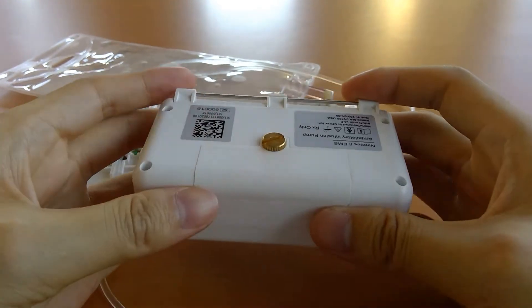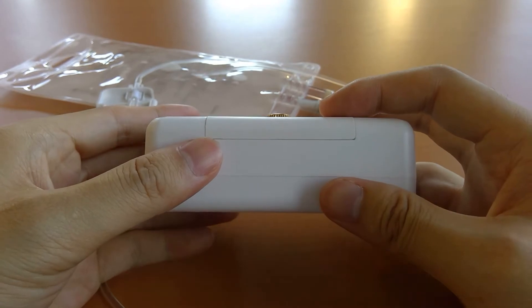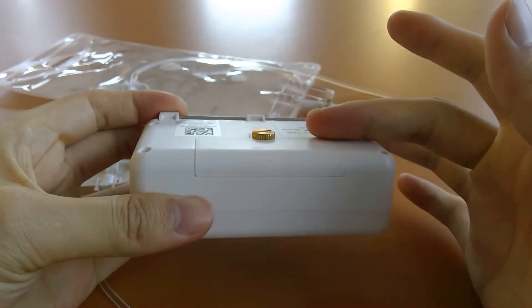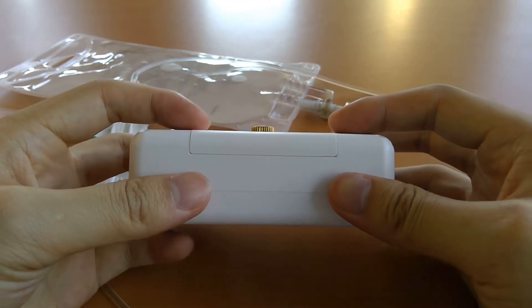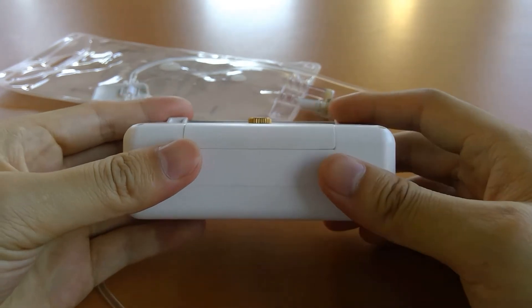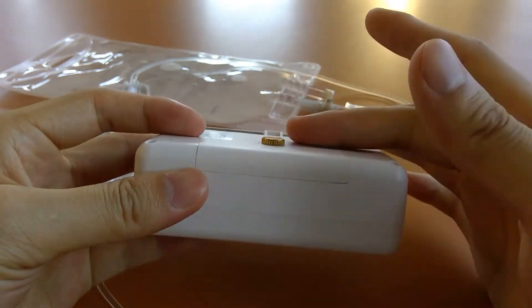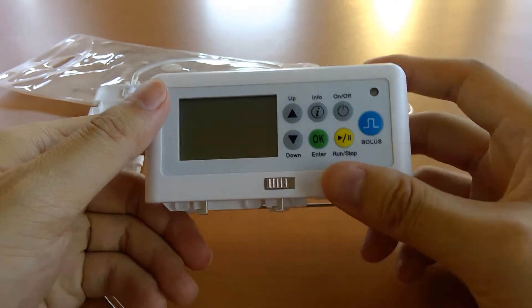In terms of power, the battery lasts for 1500 mLs or 240 hours, whichever comes first. If that runs out, you can replace the battery — it's a single-A non-standard battery, not something you can pick up at your local CVS. However, we pass that cost directly to you at $5. You unscrew it, pop the new battery in, turn the pump on, and it's ready to go again.